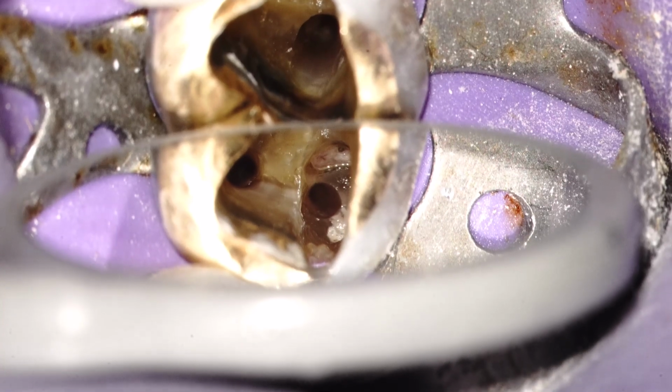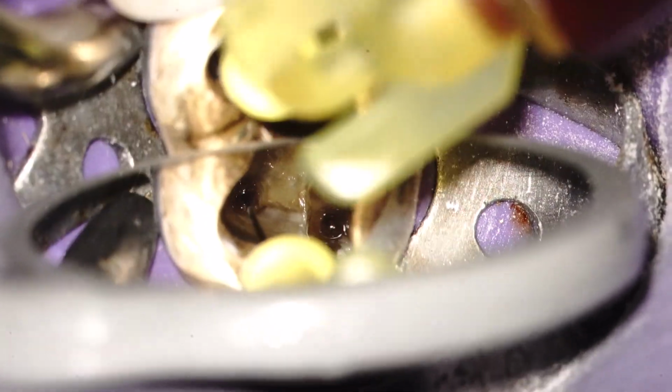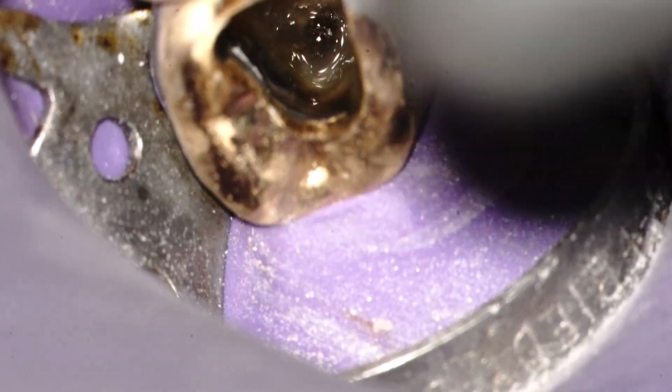We will now show video of the second visit. Here we are injecting 90% trichloroacetic acid, which is injected into the mesiolingual canal, and you can see it coming up the mesial buccal canal. I'm now injecting it into the distal canal. You can see the bubbling, now applying the EndoActivator to the TCA to disperse it in the canal system.